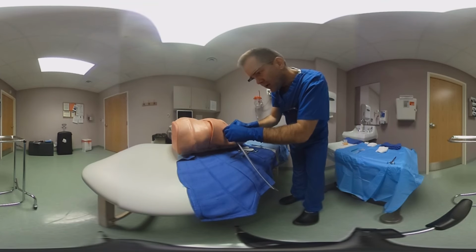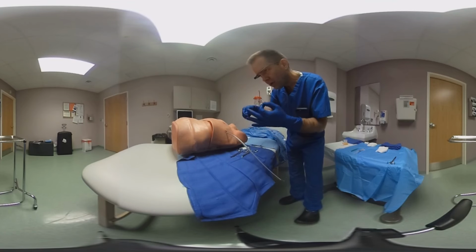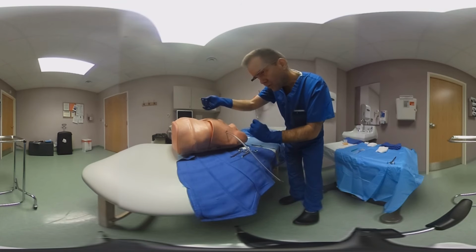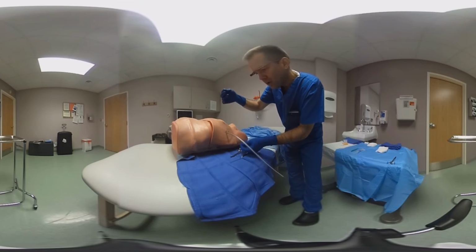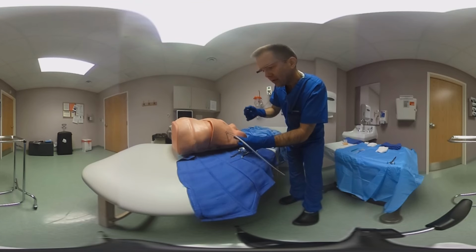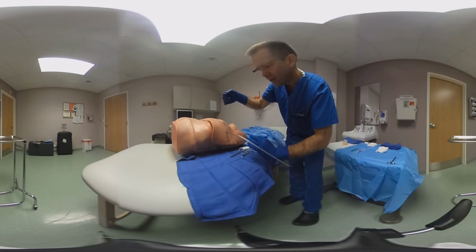I personally like to do a type of suture that secures the tube in a way that allows you to have some degree of flexibility. It's like, at the end, a Roman sandal type technique.